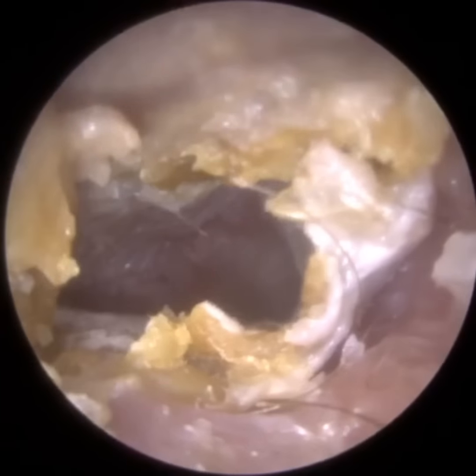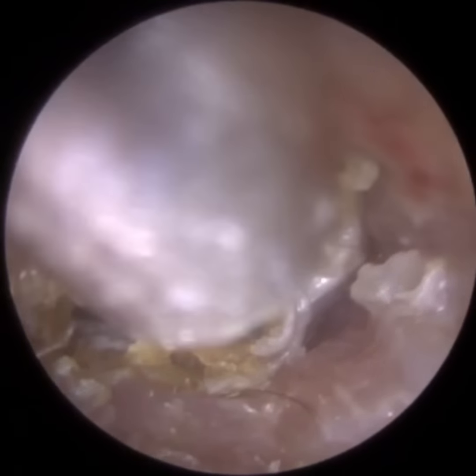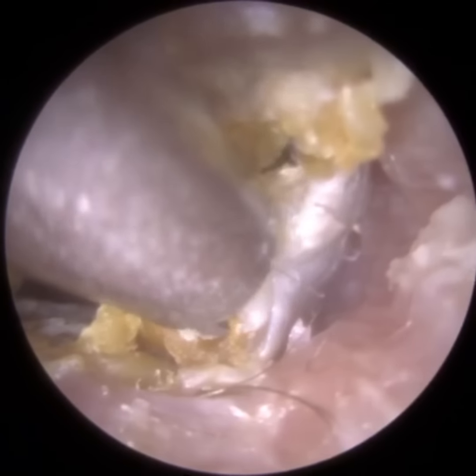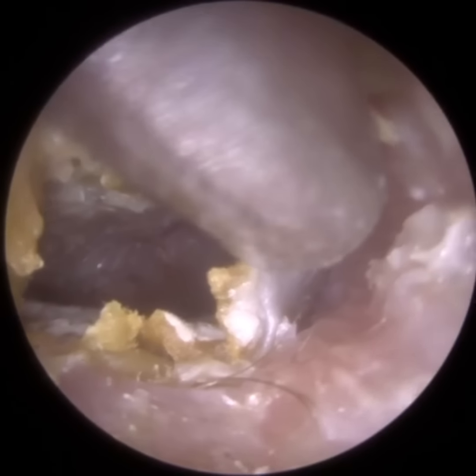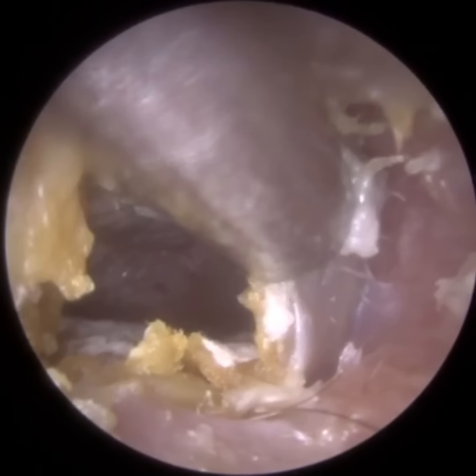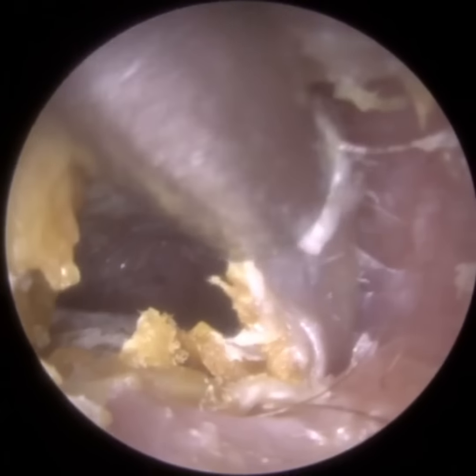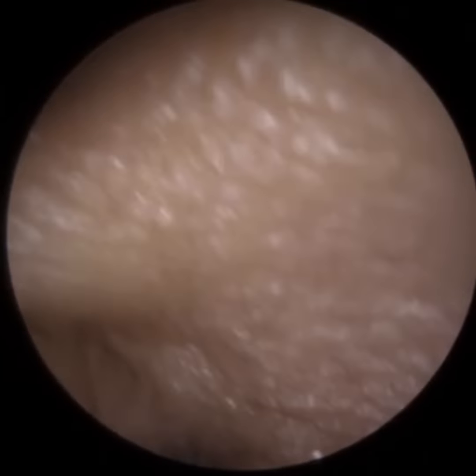The sound can get through, the pressure has been relaxed because you can see we've broken through the plug. In the distance, we've got the eardrum. You'll have a close-up of that in a moment. But we've still got quite a lot of skin here, and it's trapped. You can see the swelling around this. Again, with keratosis obturans, not only does it cause a widening of the bony part of the ear canal, sometimes you do get a swelling of the ear canal which engulfs this plug of skin into the ear.